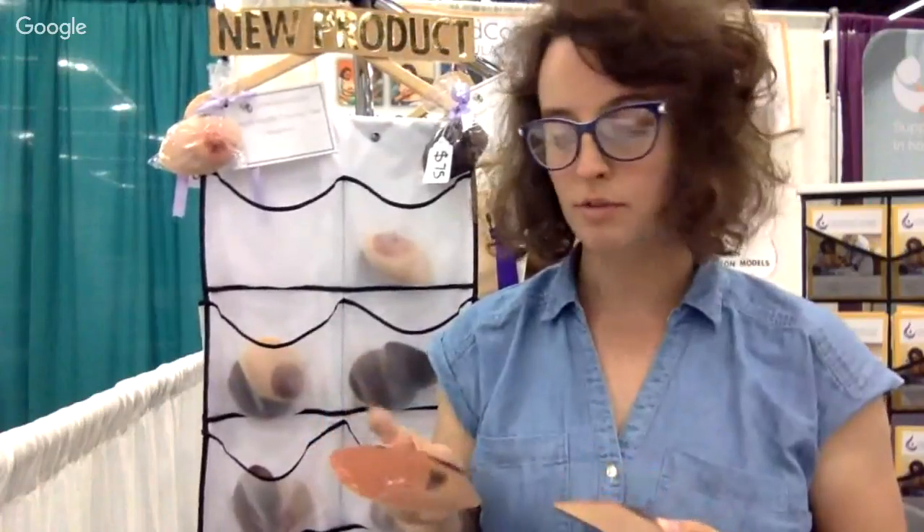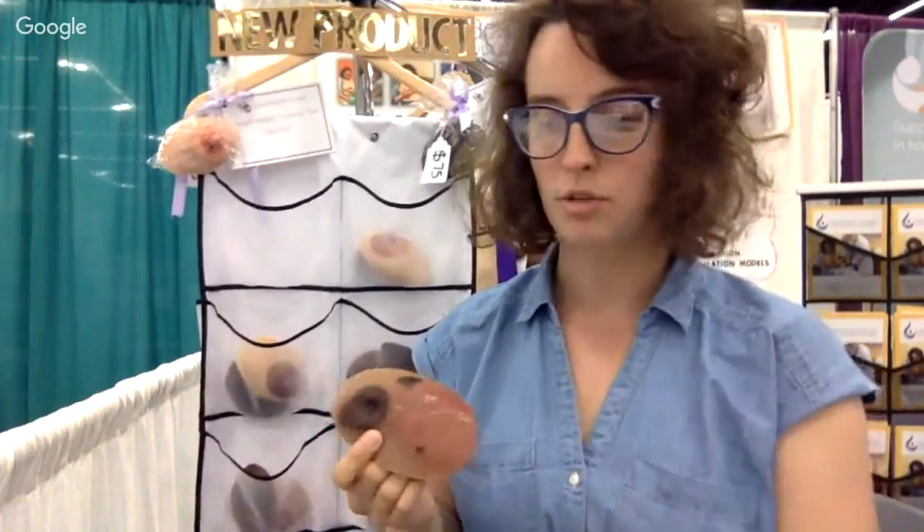So we wanted to make sure that physicians, nurses, students, and lactation consultants especially know how to think critically about different conditions that can present commonly or uncommonly on the breast. So I just wanted to demonstrate a couple of different breast health training tools that we have.